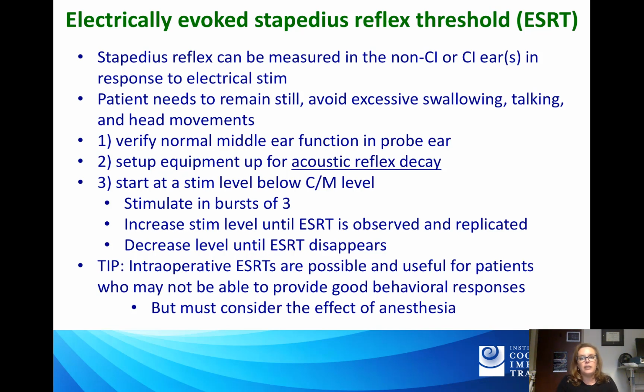So this is actually a really nice tool to use, and you get a really nice correlation between what your ESRT levels are and your upper stim levels. I do want to point out that this is a threshold, though. I'm sorry, this is a reflex. It's been a long day.